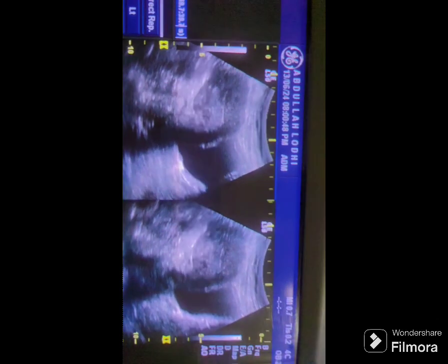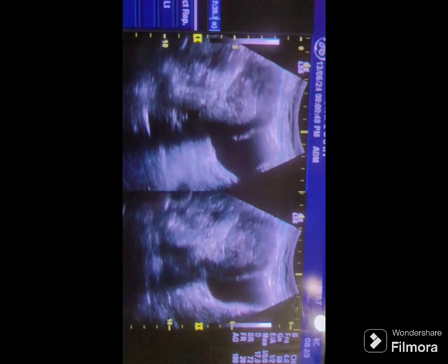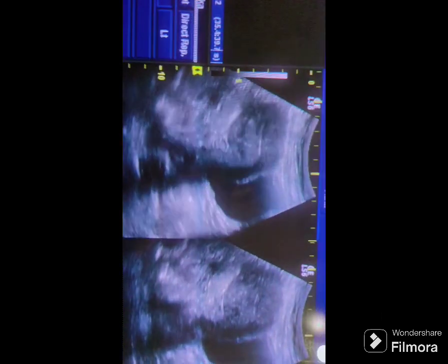Now look at this video carefully. There is a normal uterus, myometrium, endometrium. There is no fibroid, no abnormality. This is a normal uterus.